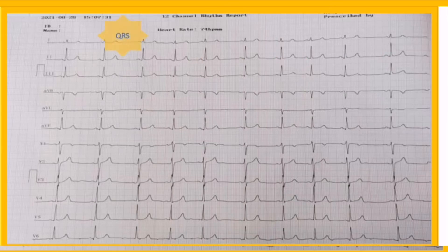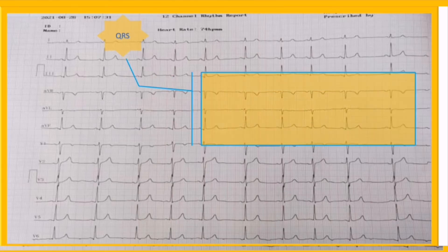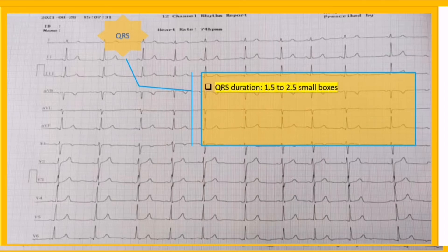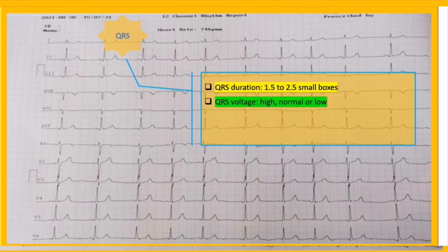The seventh step is the QRS complexes, which represent the time for ventricular depolarization. We recommend analyzing four items when examining QRS complexes. First, QRS duration: the entire QRS normally lasts for 1.5 to 2.5 small boxes. If QRS duration exceeds 2.5 small squares, we call it wide. Second, QRS amplitude: look for any evidence of low or high voltage complexes.